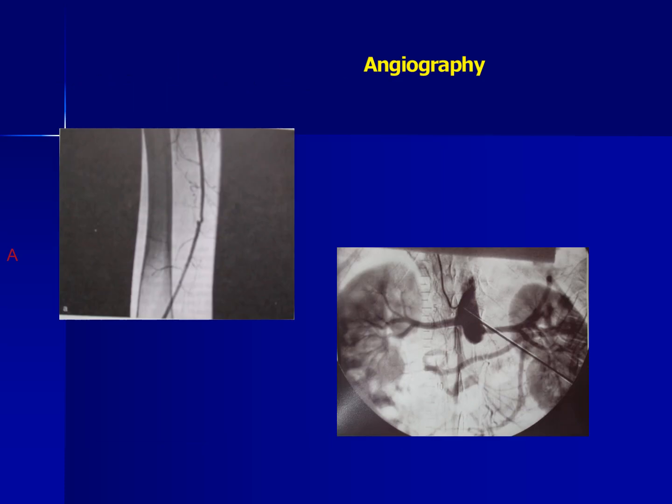Here is angiography of the femur region and also angiography of the region of the kidney arteries.